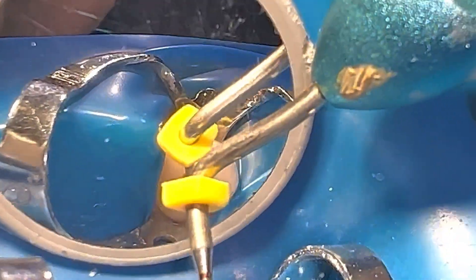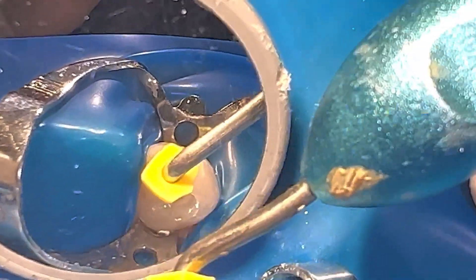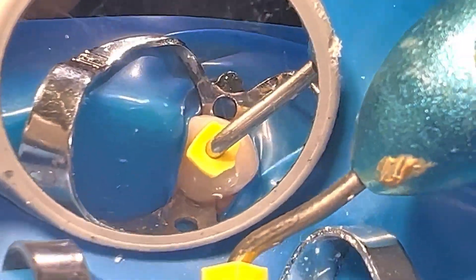Once the MTA has been placed in the canal, we gently compact it with pluggers or thick paper tips, forming a 4 or 5 mm plug.